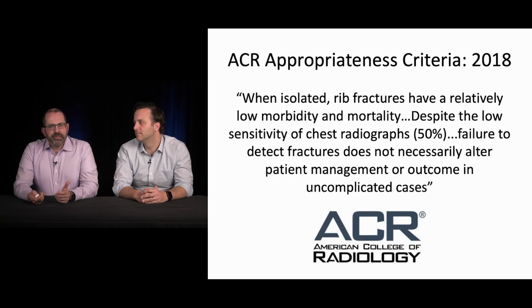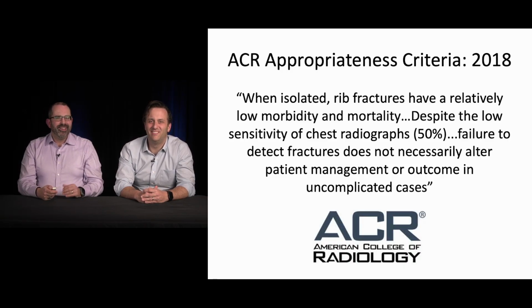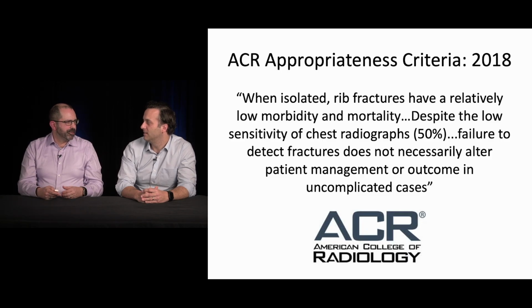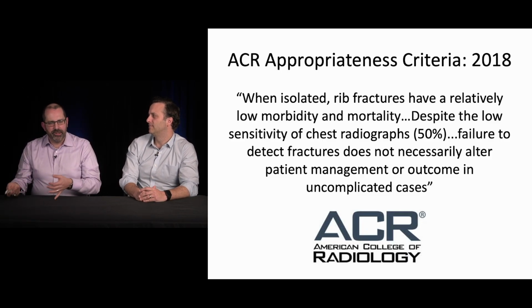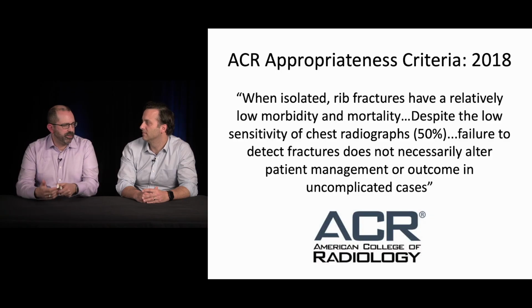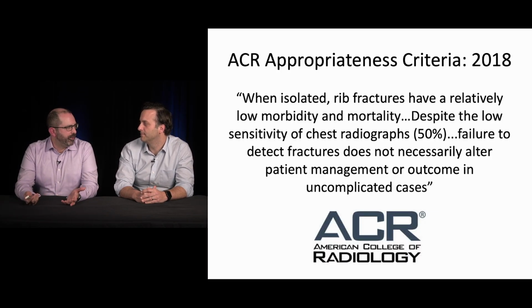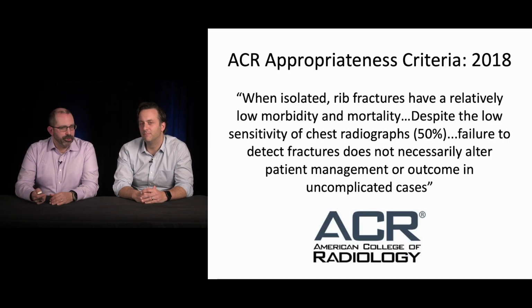Why do we care about these? We care about them more than radiology cares about them. Looking at the ACR appropriateness criteria, they really downplay the importance of rib fractures, and I think that has translated over to the radiology side because they miss these all the time. I've actually gone and done grand rounds for our radiologists, and we were talking about differences amongst our cultures and our priorities. I started talking about rib fractures, and they kept saying, why do you guys care so much about the rib fractures? You guys don't do anything with them anyway. And that's absolutely not true.